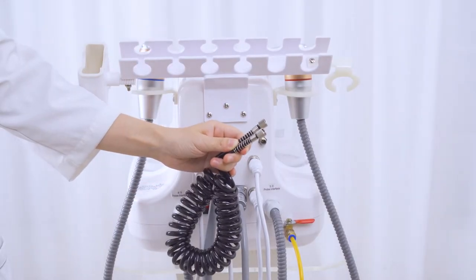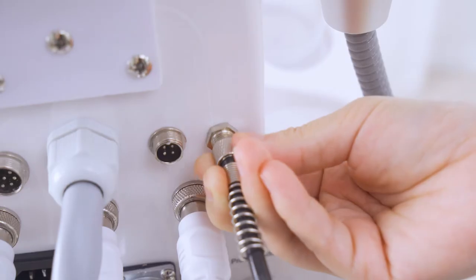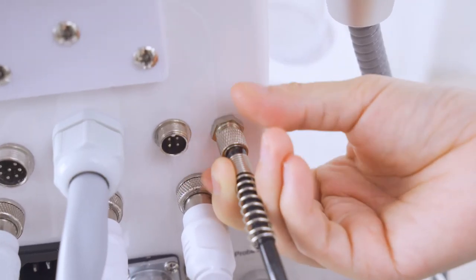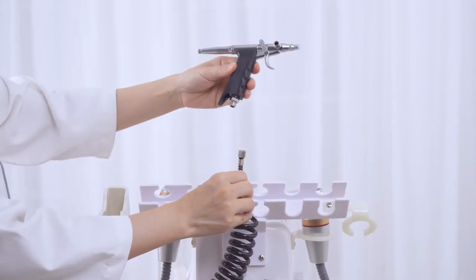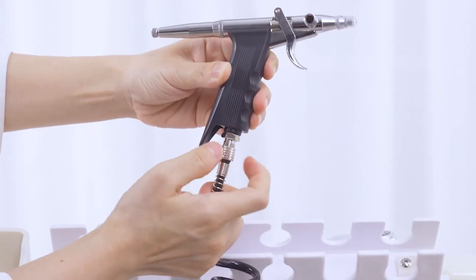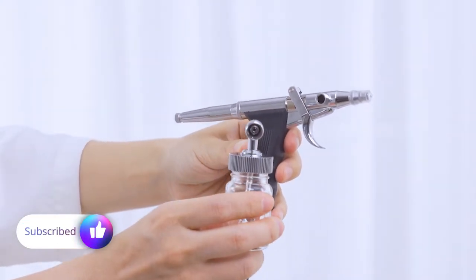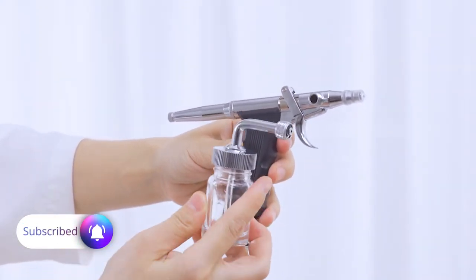Insert one end of the oxygen spray handle wire into the machine jack, then connect the oxygen spray handle with the other end and tighten the screw. Connect the spray bottle with the handle and tighten the screw.